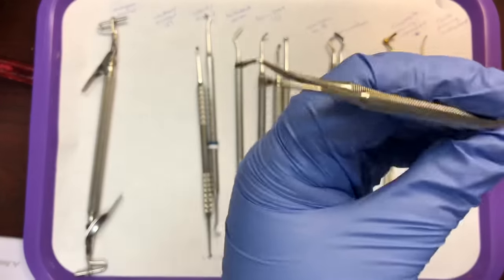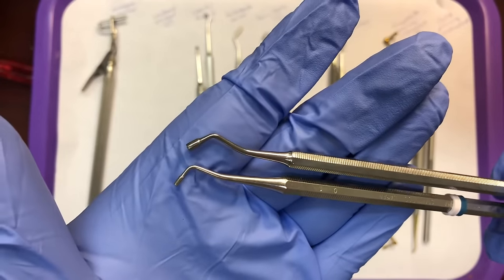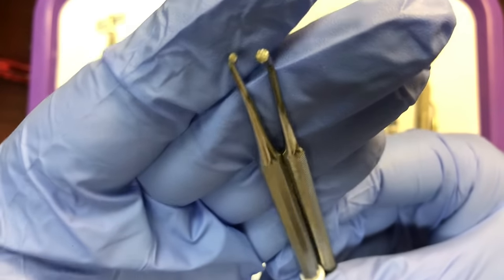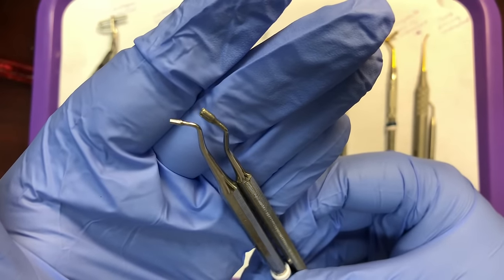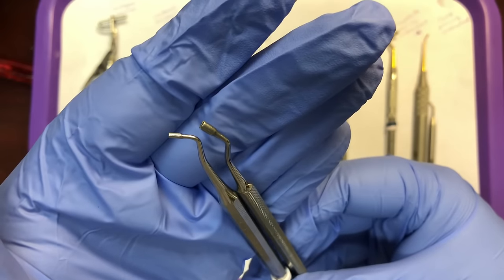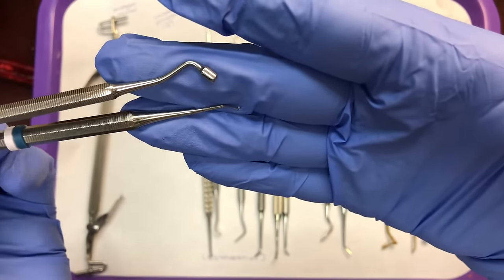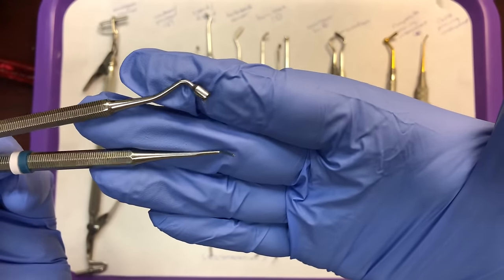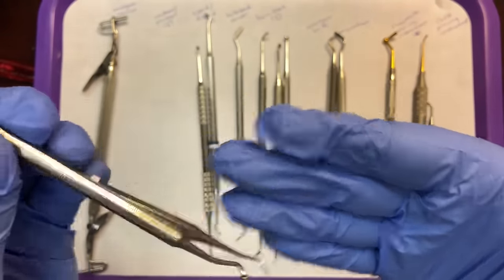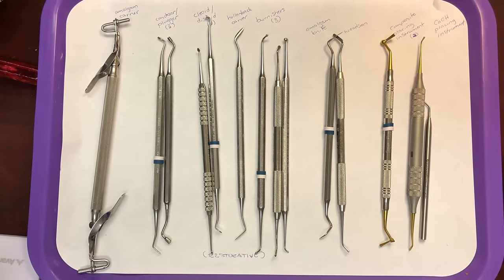Next are condensers, sometimes called pluggers. They have a solid cylinder-like shape at the working end, and come in two different sizes — medium and large, double-ended. The size depends on how large a filling you're doing. The purpose of condensers and pluggers is to condense or pack the amalgam in place.